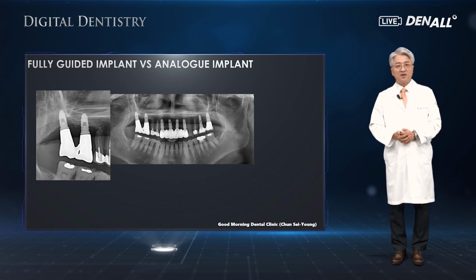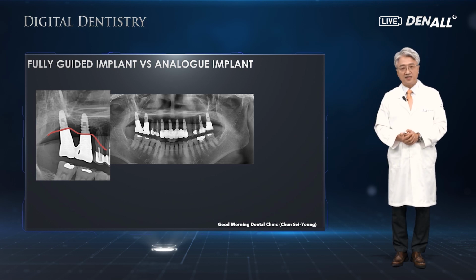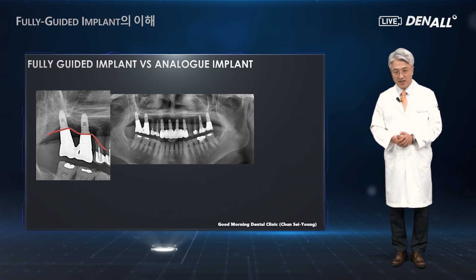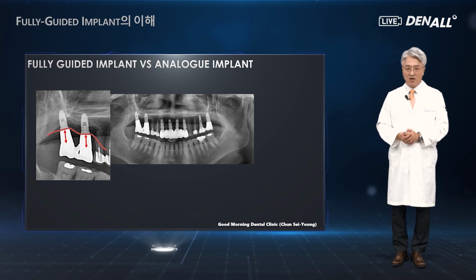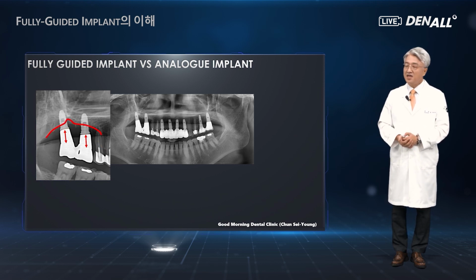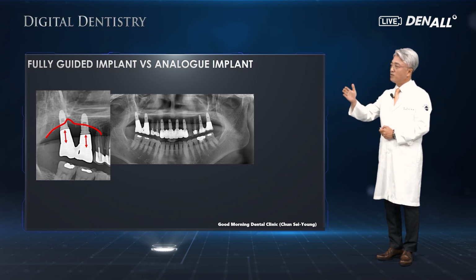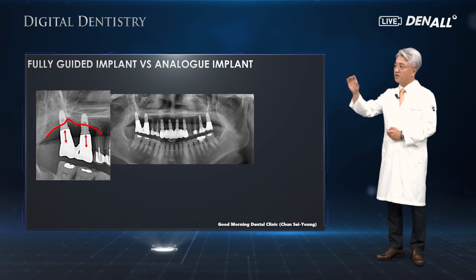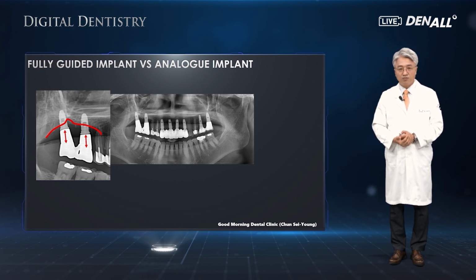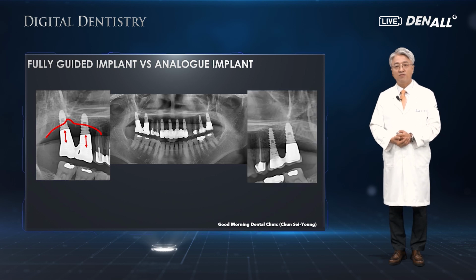In the past, the implants were placed in another dental office, and the patient came to my office. I believe that the original bone height was like this. The patient said they were placed a long time ago. The abutment is designed like this, very long. Currently, the bone is resorbed to this level. In my opinion, the abutment is quite long. In these cases, it is not very good for self-cleaning and tooth cleaning. Therefore, the bone is resorbed quite severely.